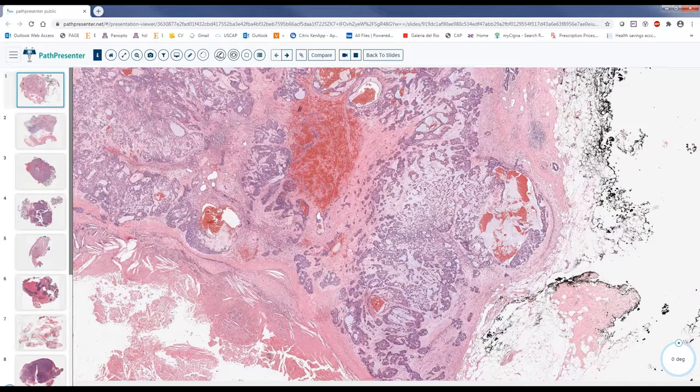Okay. And usually we don't do immunostains. This is a morphological diagnosis, and most of the time you just go with the H&E stain, that's it. However, sometimes you do some immunostains, especially in fine needle aspirations. The descriptions say that sometimes the pleomorphic adenoma is very cellular, and sometimes it's myxoid. So it is either way. The cellular part is the tricky one, especially on fine needle aspiration.